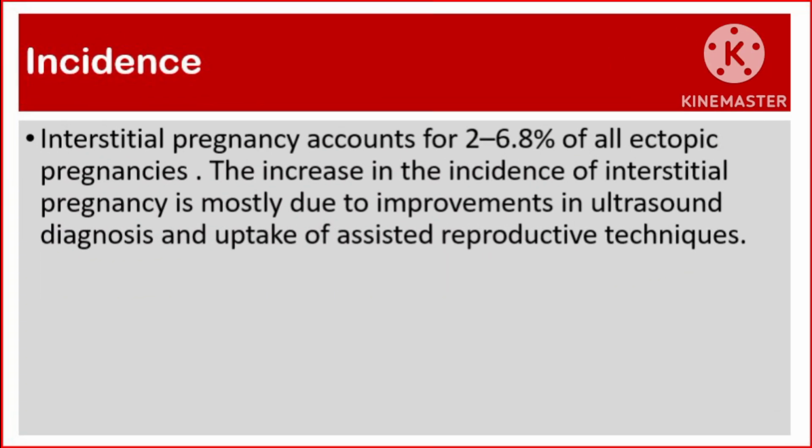Incidence: interstitial pregnancy accounts for 2 to 6.8% of all ectopic pregnancies. The increase in the incidence of interstitial pregnancy is mostly due to improvements in ultrasound diagnosis and uptake of assisted reproductive techniques.